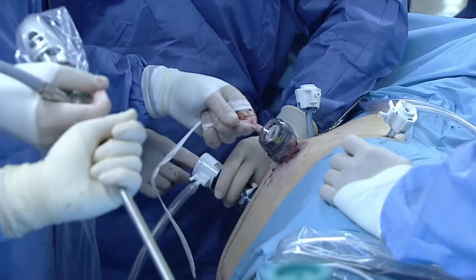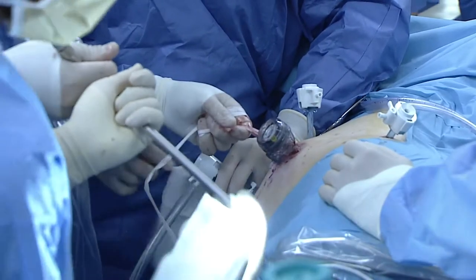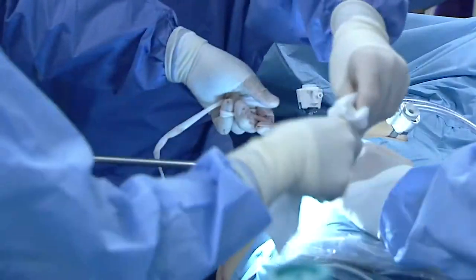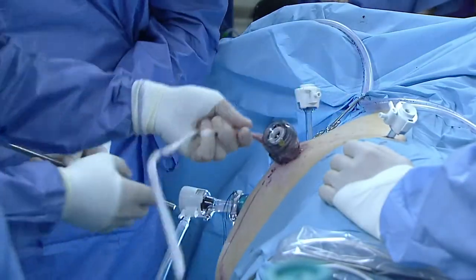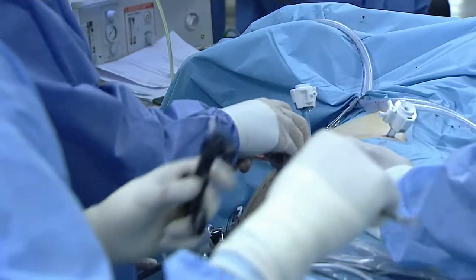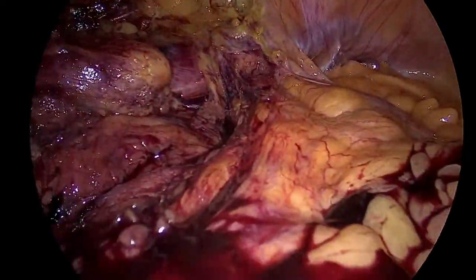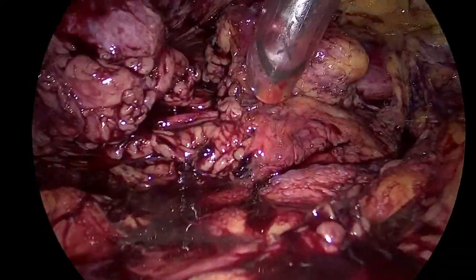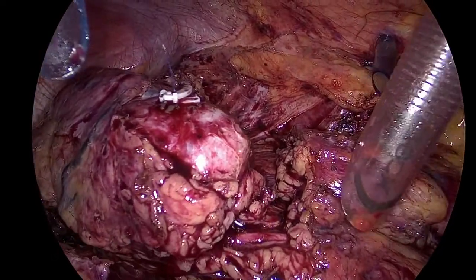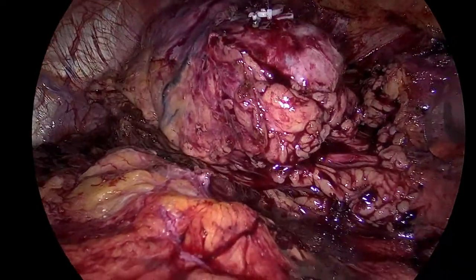Any questions, please feel free to ask them. Clean. We have decreased the gas to 5. Go. Slowly, be careful. Good. Good. Evangelos, it was very good. Excellent. Laparoscopy kidney dissection. And it's very good for us after enucleation, reduction from the tumor bed.